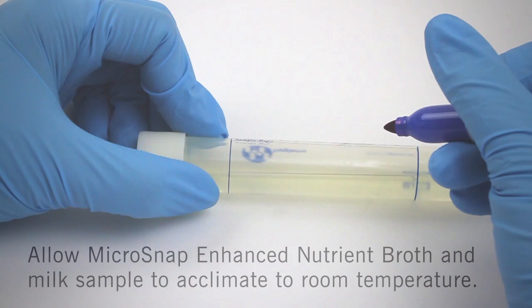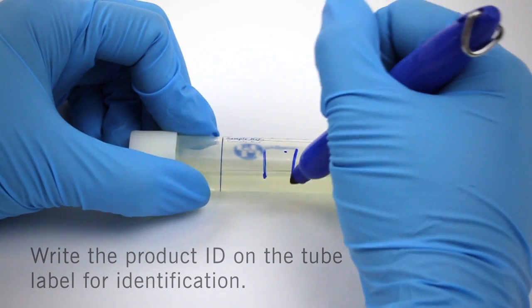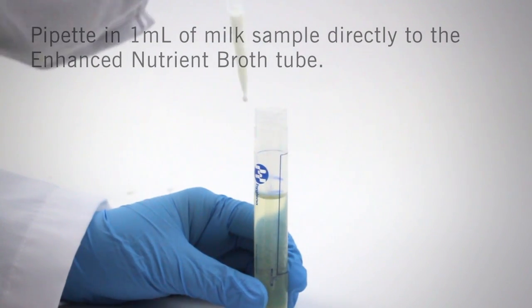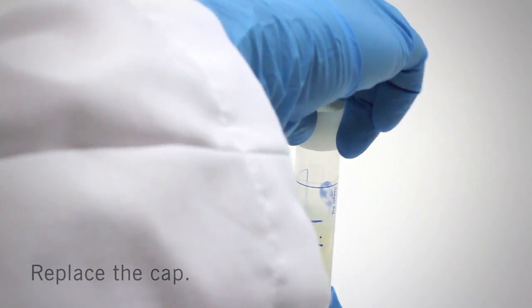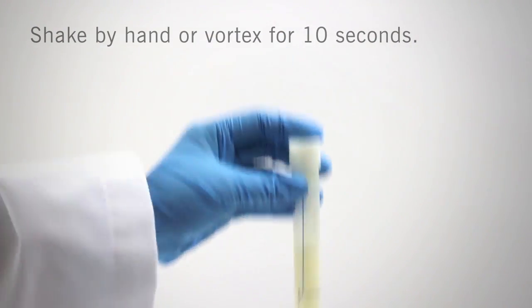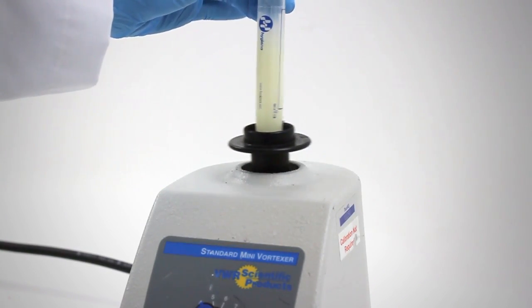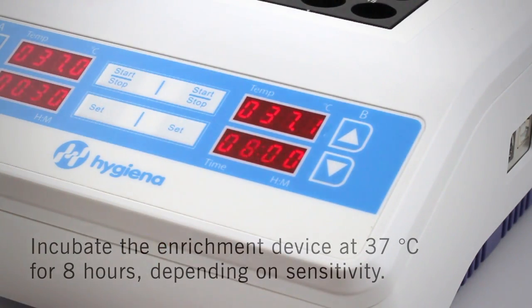Microsnap is a two-step test. The first step is the enrichment step. Allow the Enhanced Nutrient Broth and milk sample to acclimate to room temperature. Write the product ID on the Enhanced Nutrient Broth label for easy identification. Remove the cap and then pipette in 1 ml of milk sample directly into the Enhanced Nutrient Broth tube. Replace the cap and shake by hand or vortex for 10 seconds. Incubate the enrichment device at 37 degrees Celsius for 8 hours.